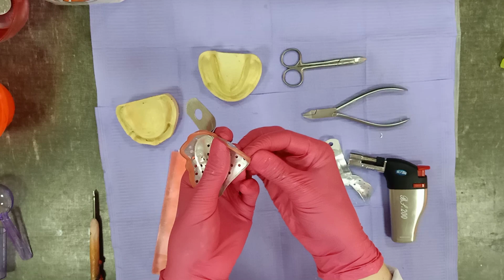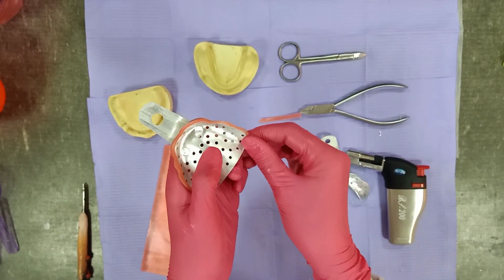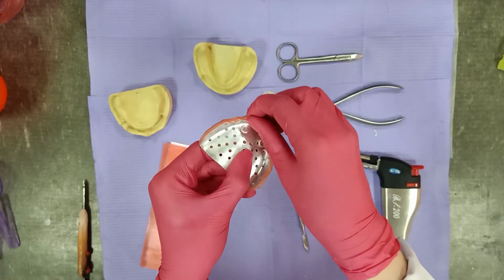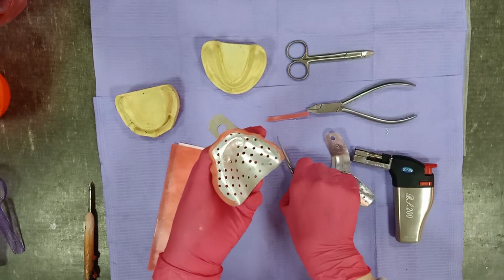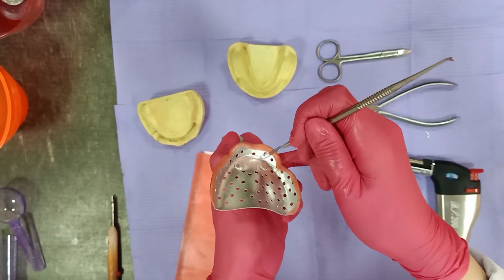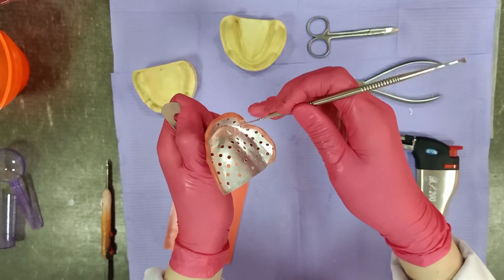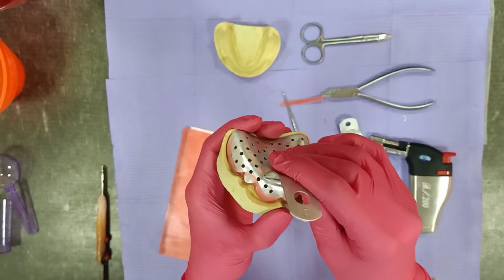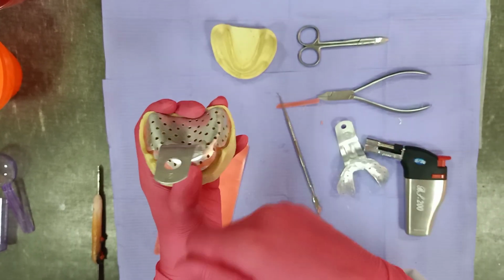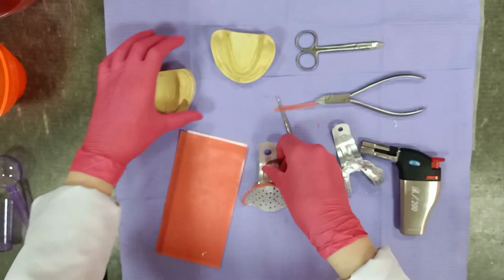This is for the upper. All the borders are covered, so there are no sharp areas present in the tray before taking the impression. Removing any excess inside the tray using your carver and your torch. Now all the borders are smooth, and you can start trimming.